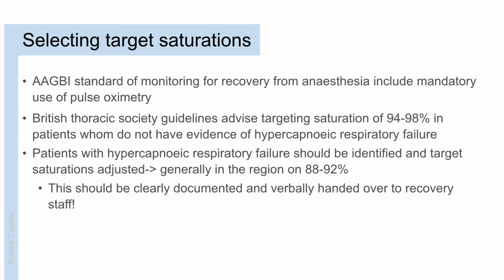The AAGBI has minimum acceptable standards of monitoring guidance for both intra-op and postoperatively, and this states that pulse oximetry is mandatory for recovery of patients.